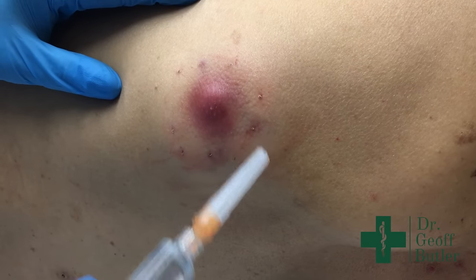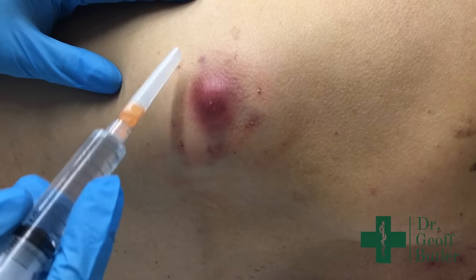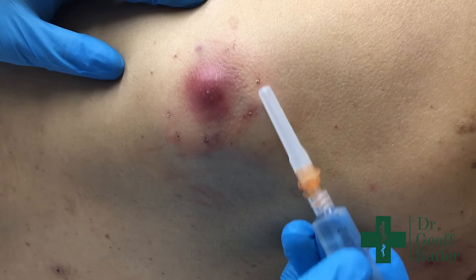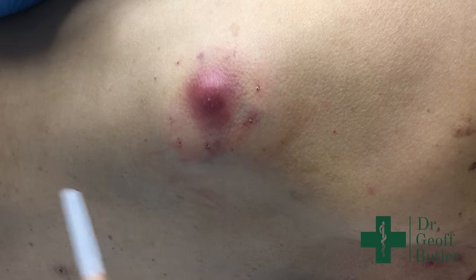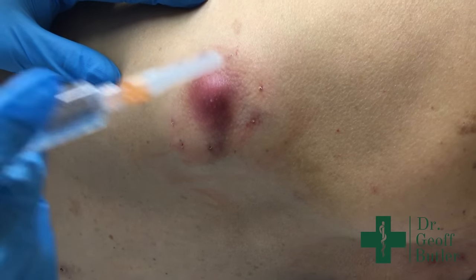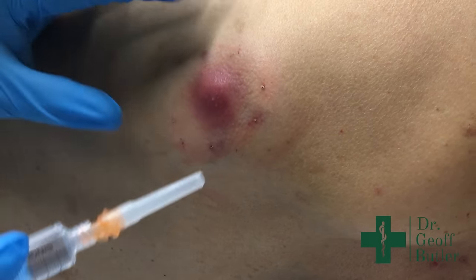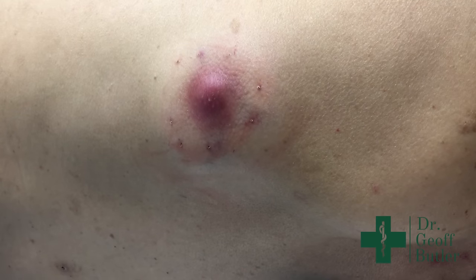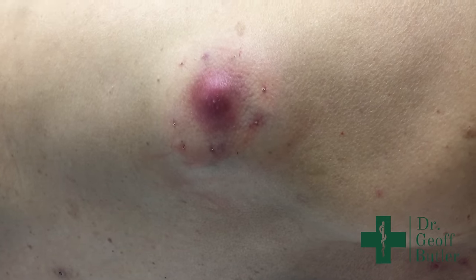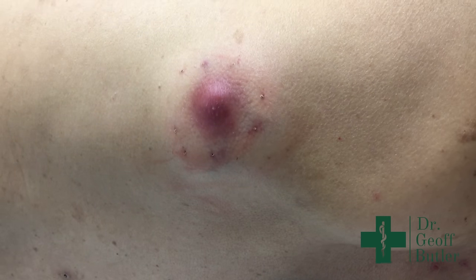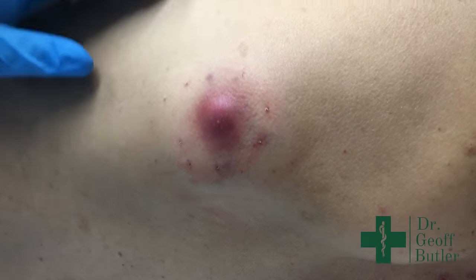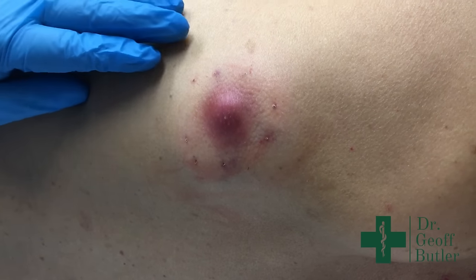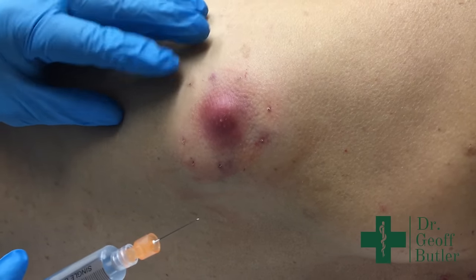So these marks you see here — I've done a circumferential block. I would tell residents when you're doing this: I've used the bovie, the hyphricator, just to cauterize them so you can somewhat clean your field a little bit. So hopefully we'll have enough freezing that this won't be too uncomfortable. It may still be uncomfortable because not only is the infection causing an acid-base problem, but in his particular case with liver issues and rising ammonia levels, his whole system may be acidic — which makes this even more difficult. So I'm going to add in a little extra freezing now.